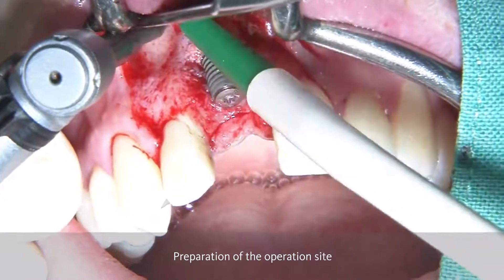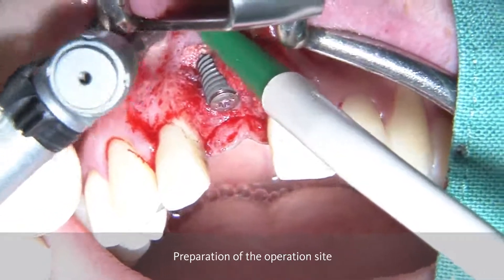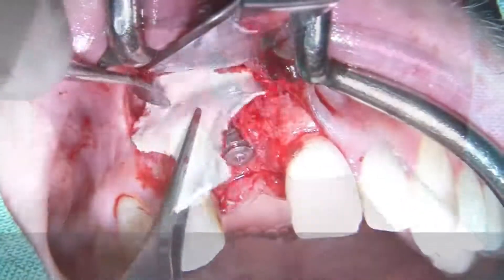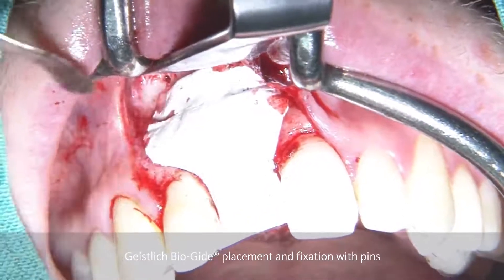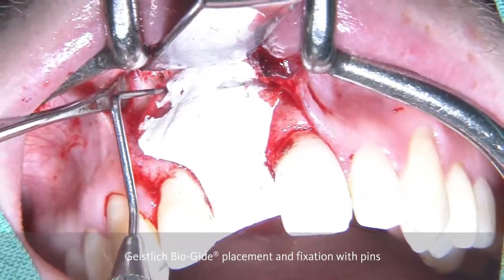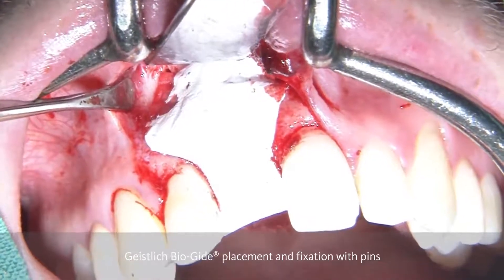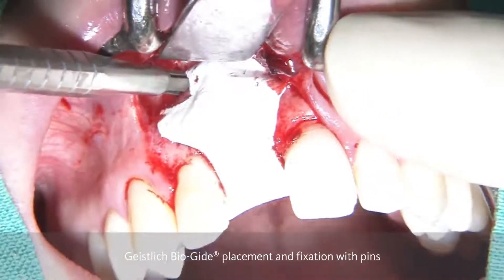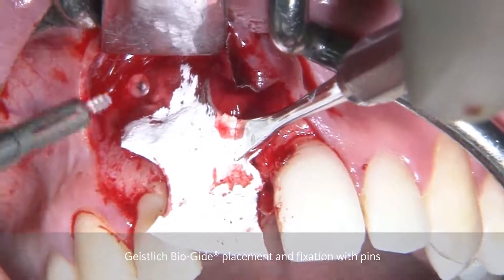After the implant has been placed, we can see that we have a dehiscence defect. Now we need to regenerate this defect. As a first step, we are preparing the site by drilling holes in the apical part — more than two — which are the ones that take up the pins to stabilize the Bio-Gide membrane, which is going to be shaped according to the defect dimensions. We can see here the resorbable pins made of polylactide, which are going to be placed in the holes in the apical part.